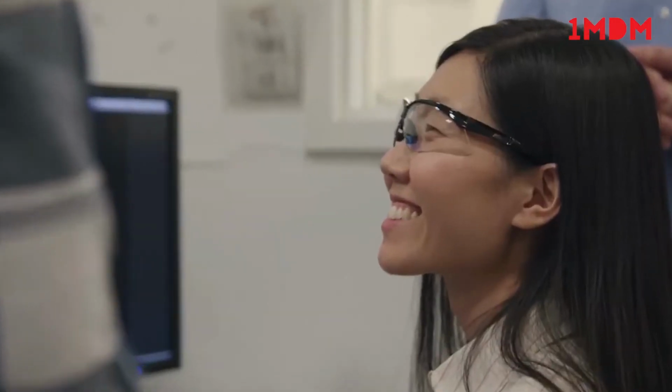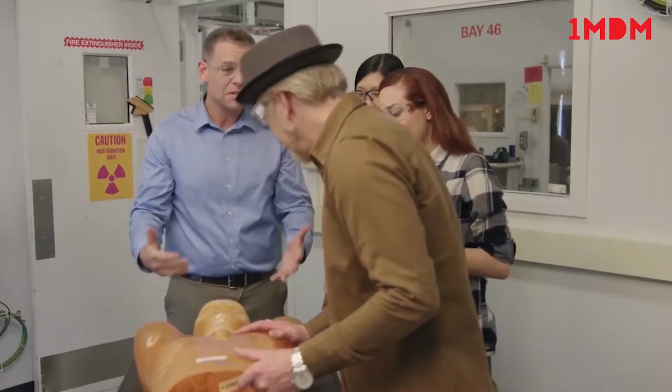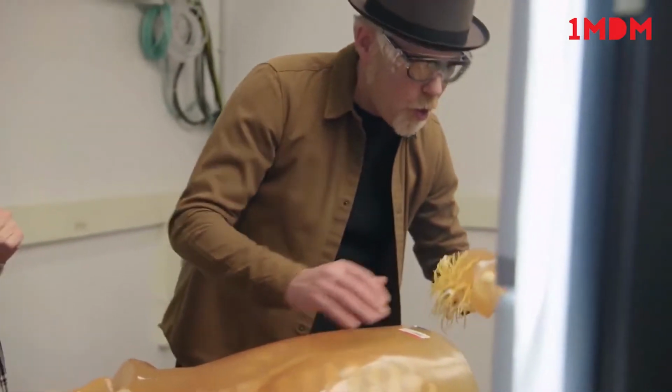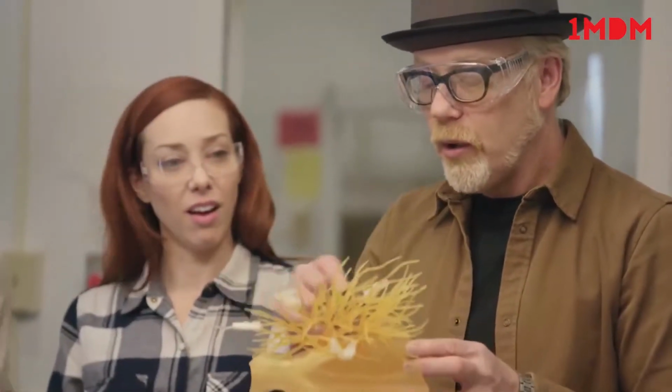This is totally amazing, and what I want to know is, can we scan something? Yeah, of course. Awesome. So here we are. Here's our anthropomorphic-based phantoms, polyurethane and epoxy resin. These are the phantoms that we use to test the system. Wait a minute. Oh, no way. So taped on there are what simulates lung nodules, spheres of different sizes and densities. We're looking for cancer. Right. So can we scan these? Sure. Choose whichever one you want. The head. Torso. Cool.